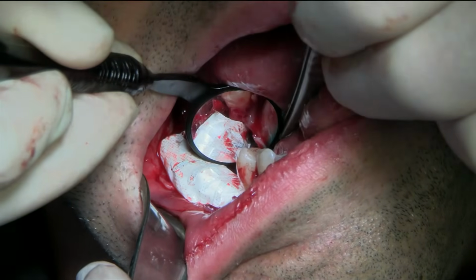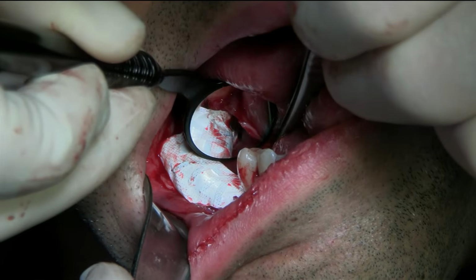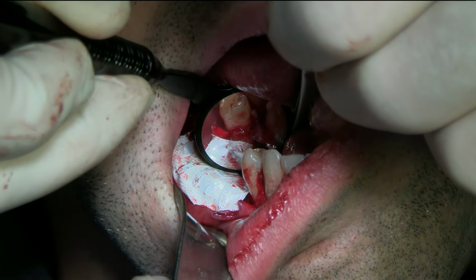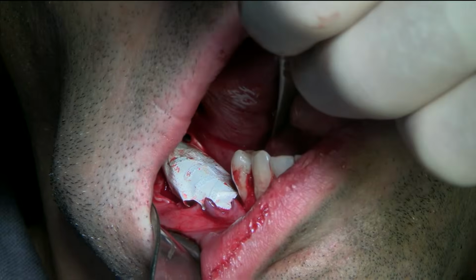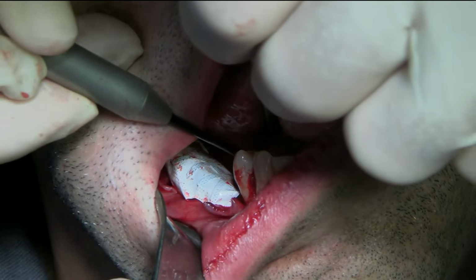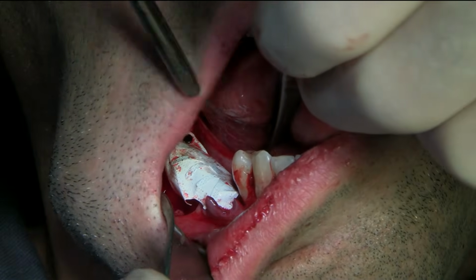So I did that blindly, I was just estimating. But it moved in there, and it's stable. Let me just double check, because I don't want these screws to come loose, because then we have no more stability. So light, I need light.